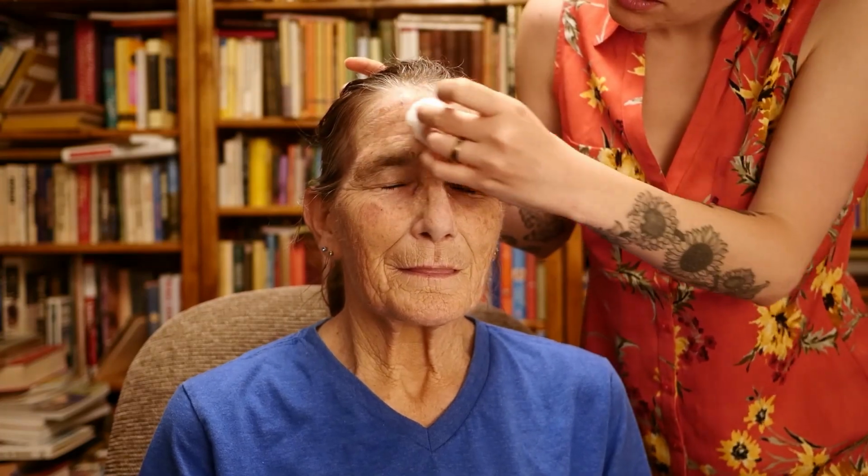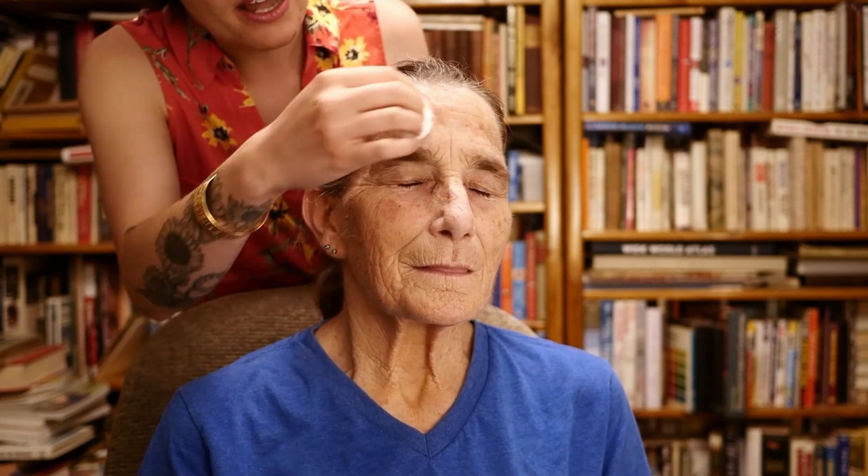We're just going to gently, you don't need a lot of pressing, because this is all going to be ever so slightly abrasive built in anyways. And this will get off any sweat or anything else that we are having trouble with, and make sure that our FP1, F7, and F8 are in excellent condition. Now, if you happen to use a lot of NuPrep, go ahead and wipe off excess.